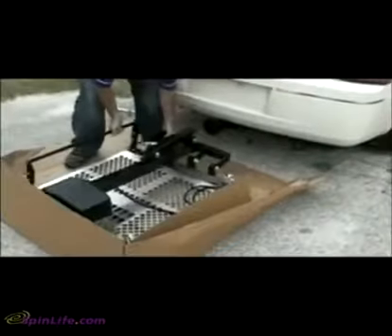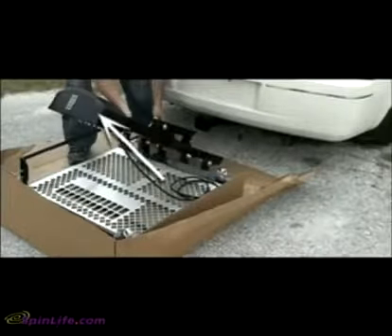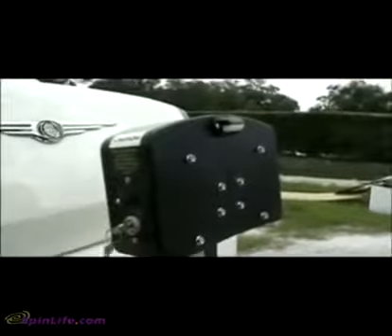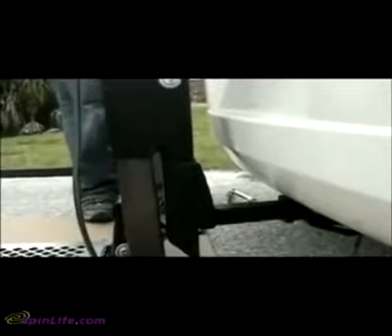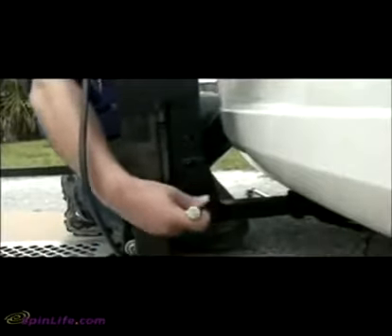Raise the lift to the upright position by grasping the outer tube. Make sure never to lift from the plastic motor box cover, as this may cause damage to your lift. Align the lift with the hitch adapter. Insert the key and turn it to the on position. Power the lift down — this will raise the hitch post into the hitch adapter. Continue until the bolt holes are aligned, then insert two bolts and tighten.